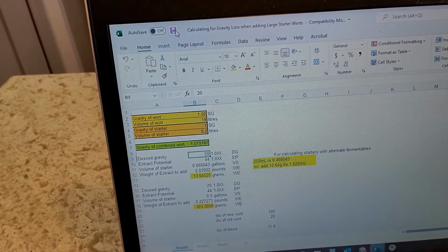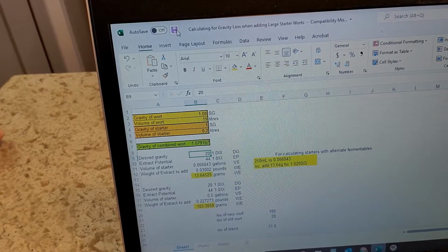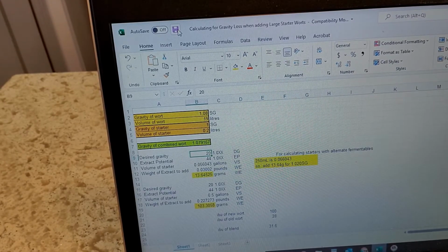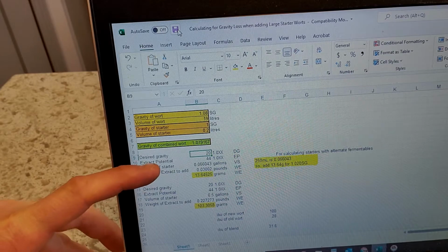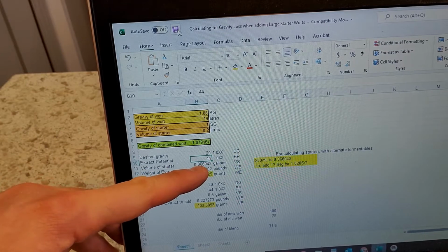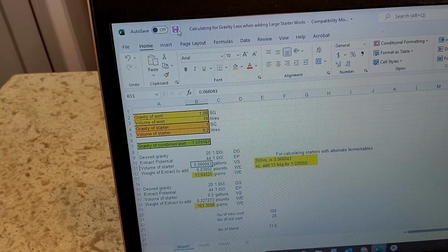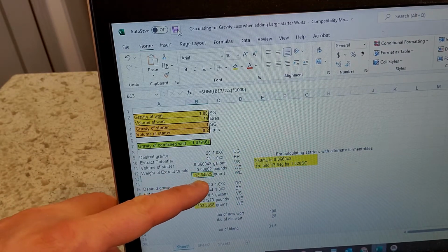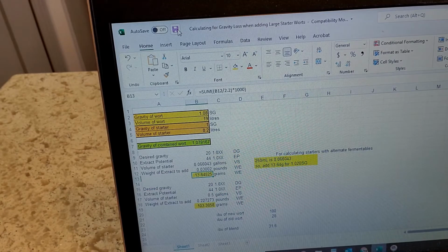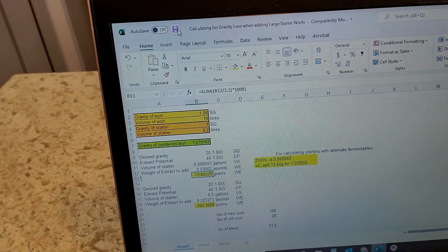So when actually calculating the amount of DME that I need for this, I just used this little spreadsheet that I built back years and years ago, back in, it was 2009 when I initially did this. And this was based on, I believe, a calculation in Palmer's How to Brew. So what I've got here is this desired gravity that I wanted was, as you know, 1020, extract potential of the DME, the volume of the starter, and so 250 mils is 0.066043 gallons, and then the weight of the extract here is the 13.64 grams. So this here is the actual calculation that I use for that.